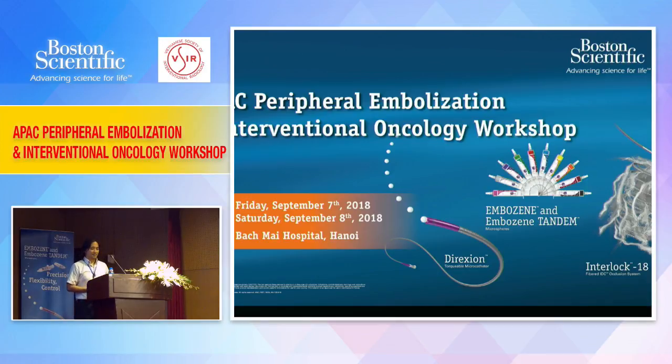I have one question. Is it easy to have 2, 3 catheters just sitting at the origin of the renal artery when you're doing that? Because you have the balloon across, you have 2 balloons across, and you have another one that's the microcatheter going to deploy the coils. Is it stable at the renal artery origin when you have 2 to 3 catheters, 4 French catheters, right at the origin?